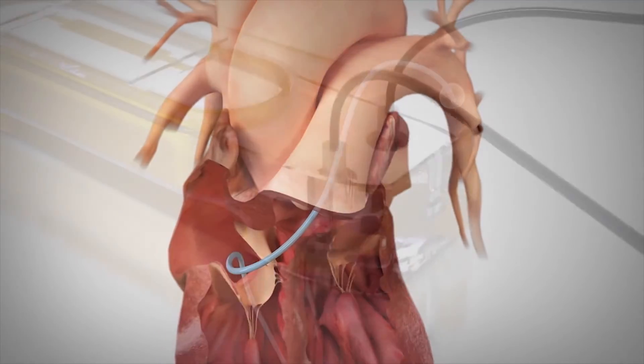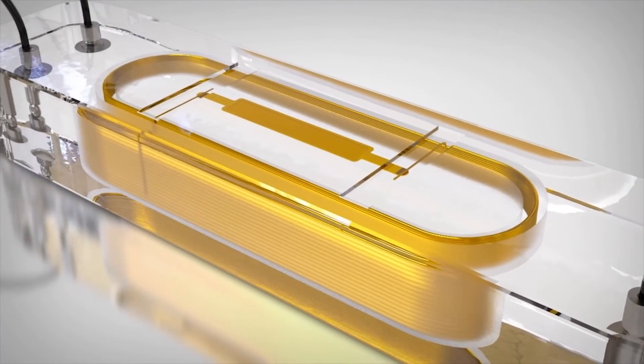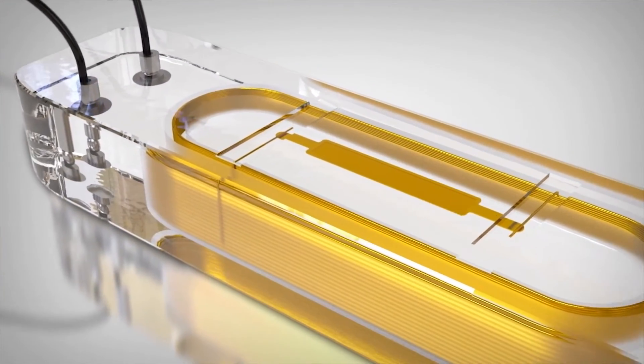During the implant procedure, the sensor and PA catheter mean pressures are matched. After the implant procedure, the sensor provides accurate PA pressure measurements and is unlikely to require future adjustments.